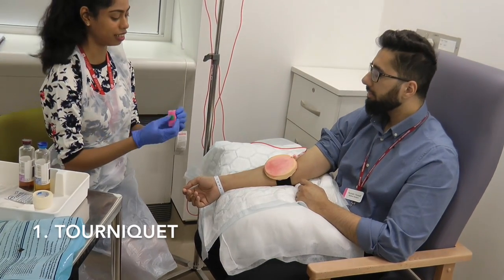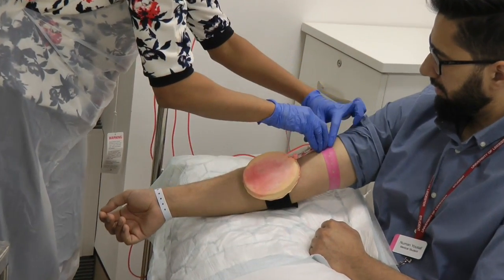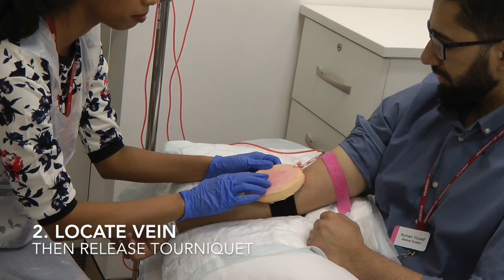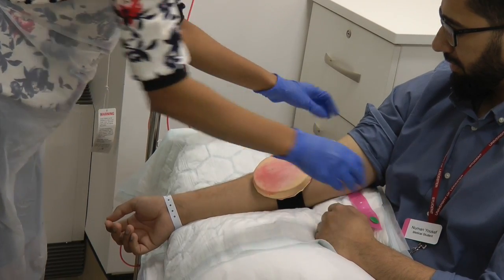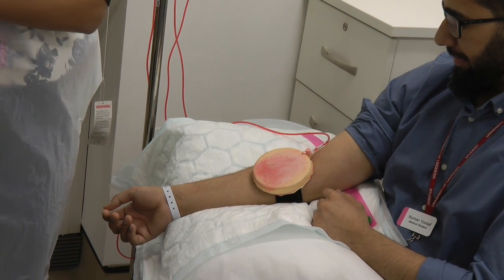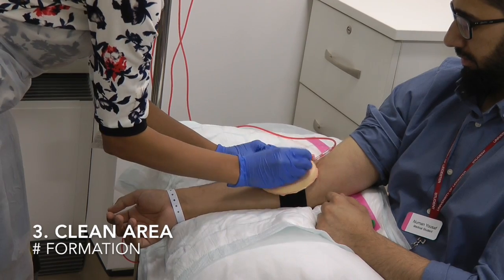I'm going to start by placing this tourniquet on your arm. It will feel a little tight — it shouldn't be too painful. I'm just going to feel for a vein. I'm just going to clean the area. In a hash formation. How long would you clean for? 30 seconds. Okay, that's done.